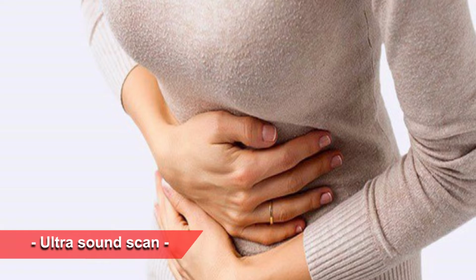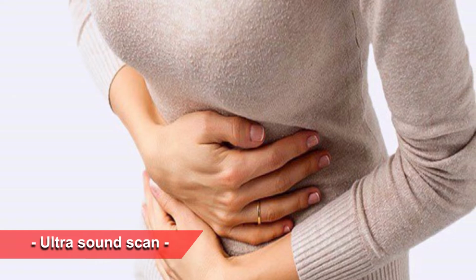The second use is to date the pregnancy, because not all women have regular periods. In case of irregular periods, it's not possible to confirm the delivery date depending on the last menstrual date. So in those cases, we have to depend on the scan to date the pregnancy.